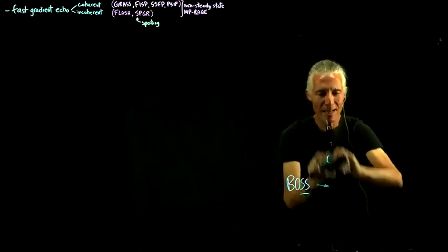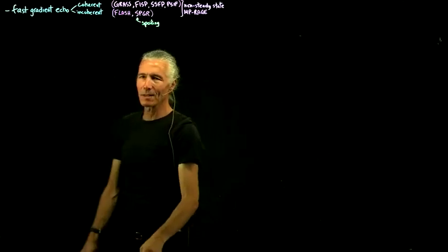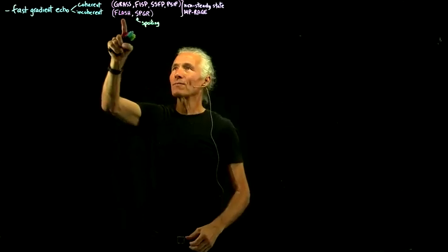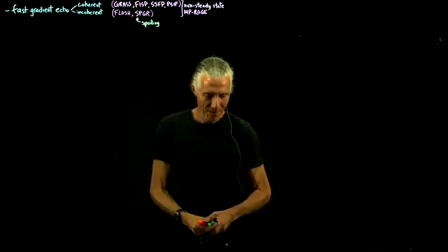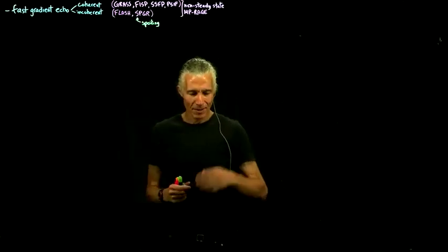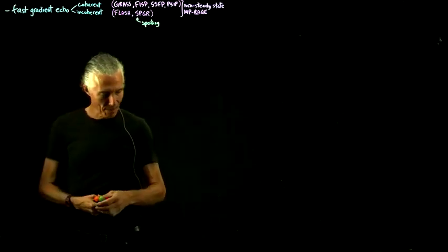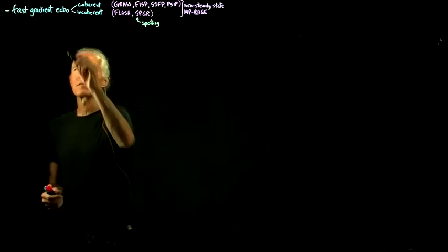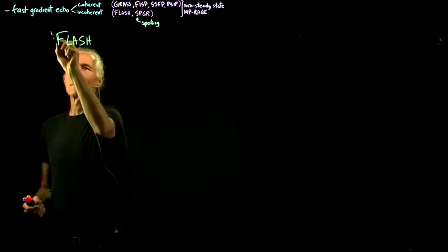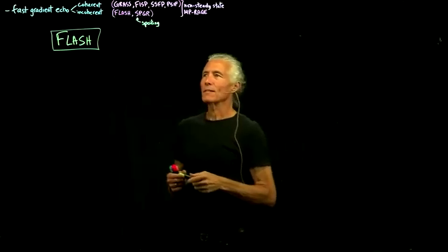Okay, so now one of the most common sequences, because every single localizer, when you first stick somebody in the magnet, the first thing you do is just do a quick and dirty localizer to find out where their head is. That's going to be one of these FLASH spoiled grass. And so how does the spoiled grass work? So I'll do a 3D example of that. So this one is called FLASH. That's probably the most common word that people use for this. So what is it?